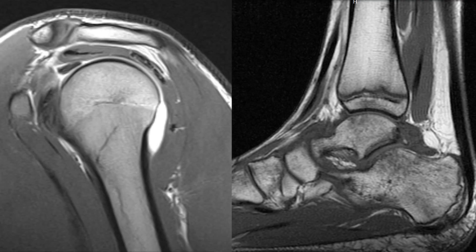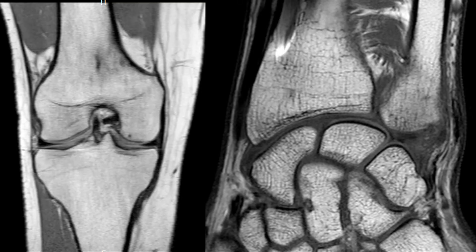The MRI images will show the bones, cartilage, ligaments, tendons, and muscles in each joint in a much more detailed fashion than can be seen by x-rays or ultrasound.